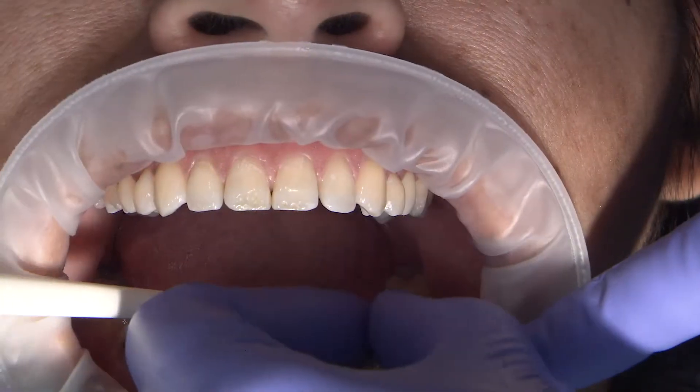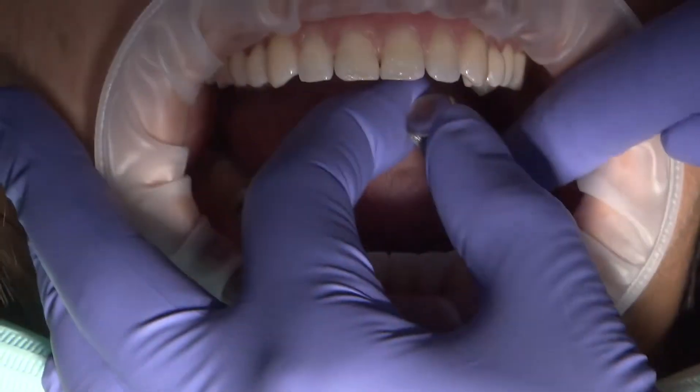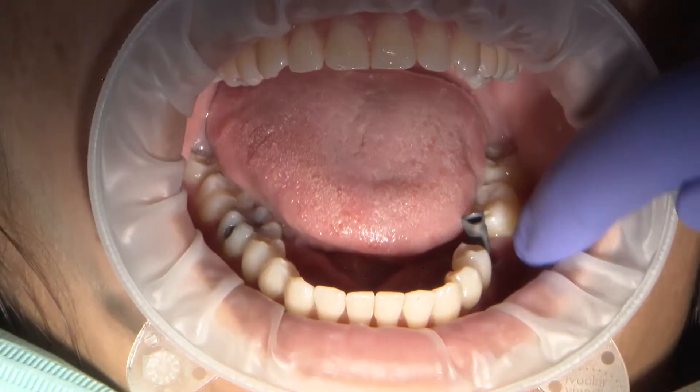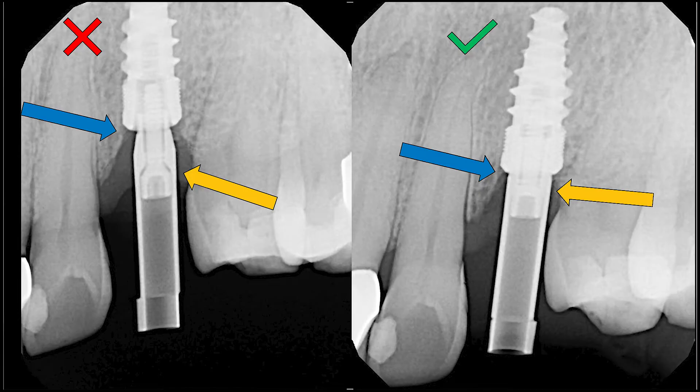Insert the scan body and hand tighten it into place. After inserting the scan body, radiographic confirmation can help to ensure it is fully seated. This is an example of how soft tissue can prevent the seating of the scan body. On the left you can see that the scan body is not completely seated, while on the right you can see that it is now fully seated, engaging the connection of the Han implant.